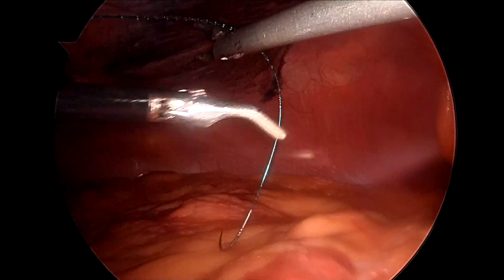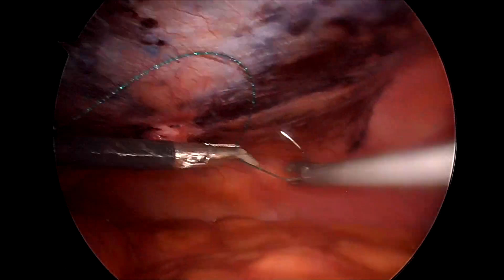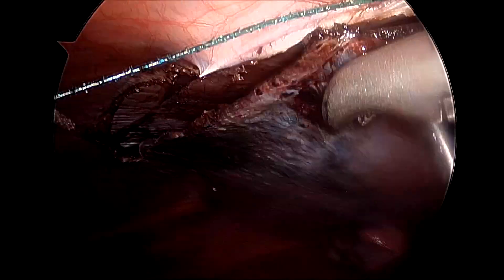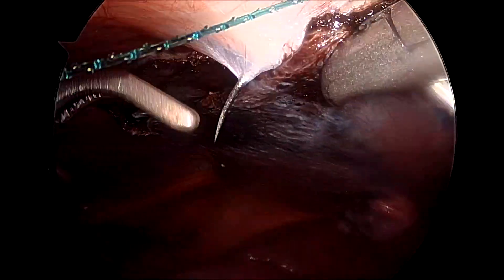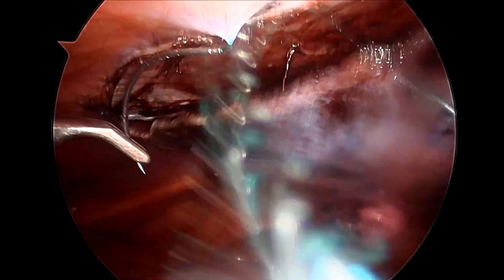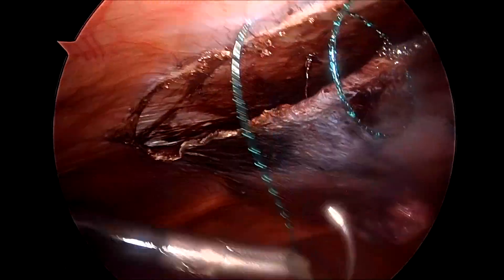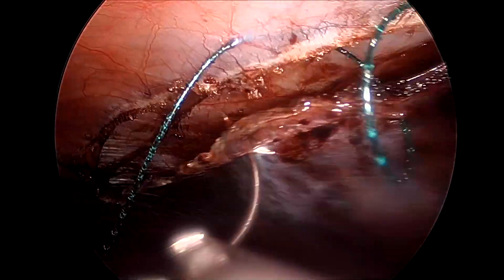I have not tightened the suture or pulled it after every bite. A small trick is that you take a couple of bites and then pull the suture — this also helps in force distribution and prevention of buttonholes onto the peritoneum while closing the flap.